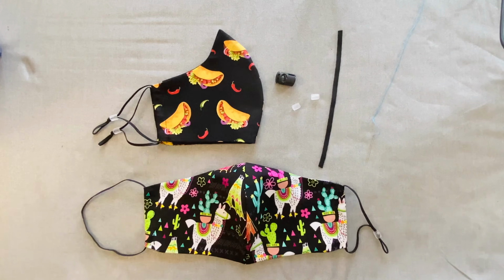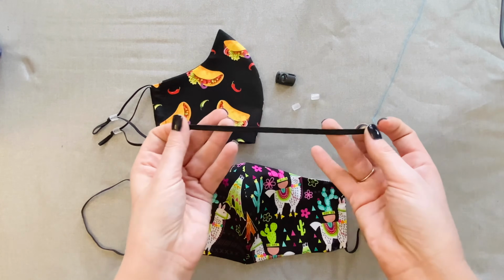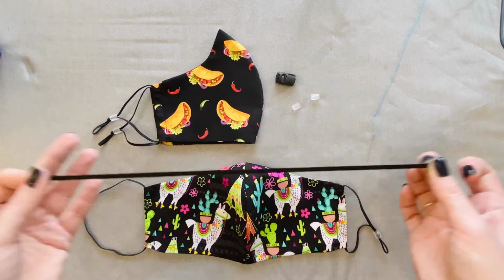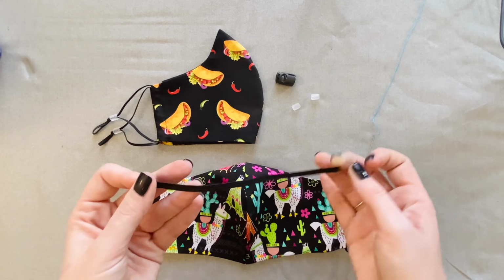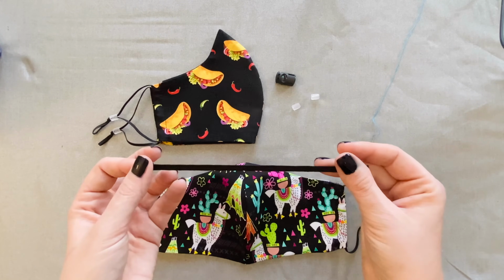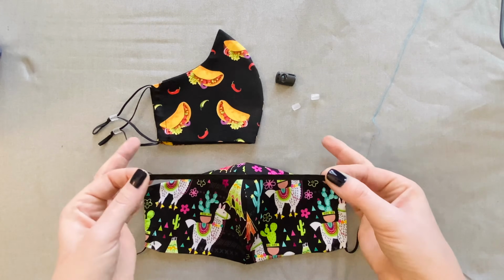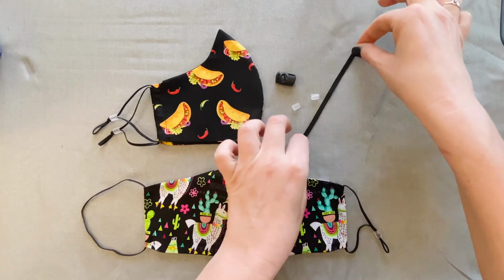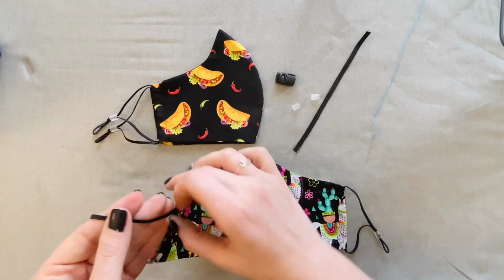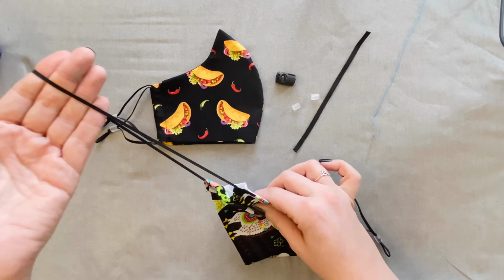Now, first things first, the type of elastic. This right here, this is 5mm wide elastic. This is what I use for adult masks. Does this work for kids' masks? Yes, but I think a little bit of a thinner elastic is a little bit more comfortable for them. So I'm just going to put this aside. I wanted to be able to compare it. For kids' masks, I've been using a 3mm wide elastic.